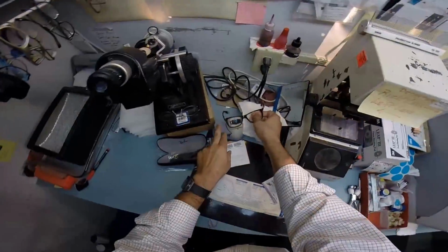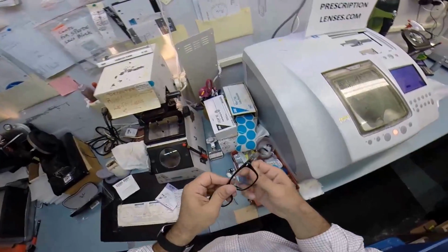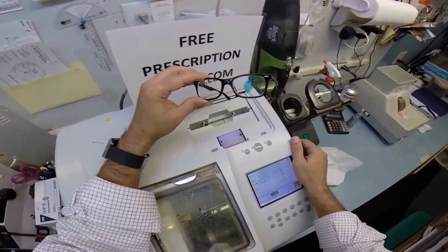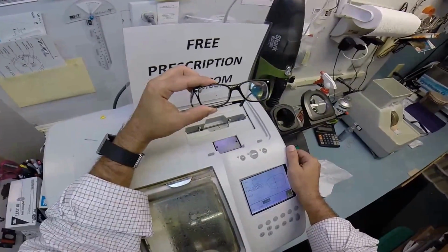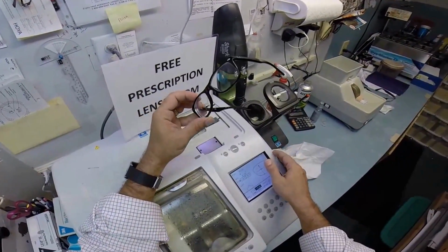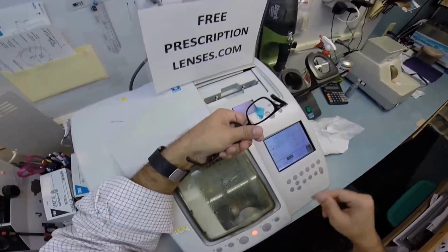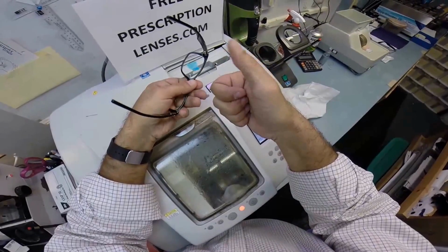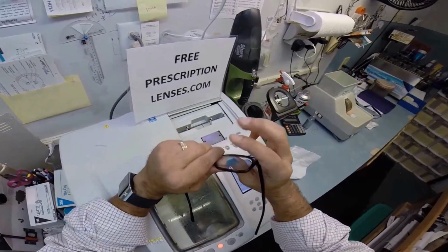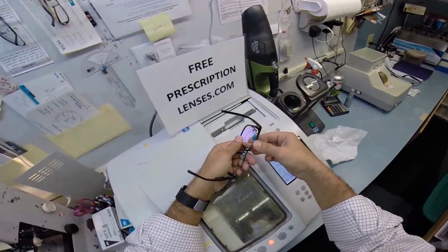Let me show you how I take the lens out. Come on, peel off, there we go. In order to take your lenses out, should you ever need to, or in the future, Kathy, years from now, if you want to reuse this frame, I can always send you just lenses only. To take the lenses out, I turn the frame over with the temples pointed upward. I'm right-handed, so I grab the frame with my left hand. You're always going to use your thumbs to press downward. I put my thumb at the nose, my other thumb on top, and I'm grabbing the other side of the lens. Using my thumb, I press down, and it pops right out.